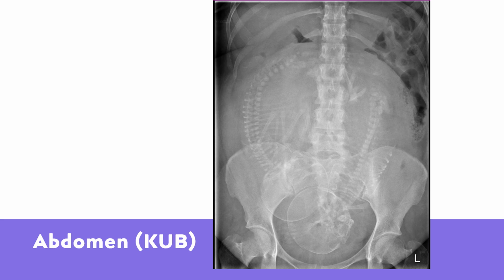Yep, the patient is 32 weeks pregnant, and this image is showing a set of twins in the belly. You can see the head of one right down in the middle of the pelvis, and then you can slightly see the second head a little bit higher, and then you can follow the spine and see the arms and legs going up into the upper abdomen there. You can also see the fluid where you can see where her placenta would be. It's amazing.